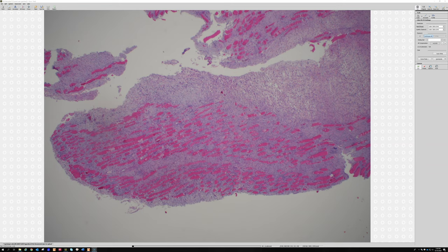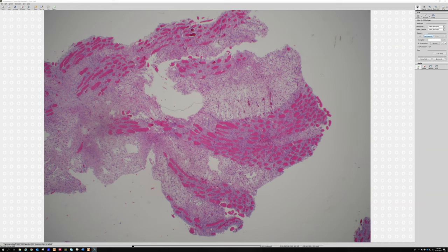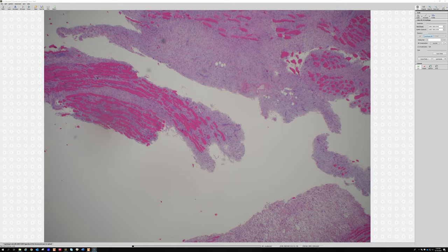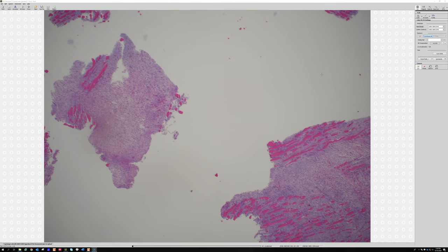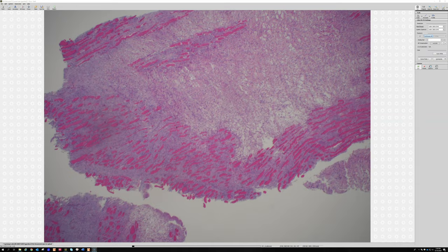Case seven: a 60-year-old male with a rapidly growing three-centimeter shoulder lesion. All these red bundles are skeletal muscle, and in between the skeletal muscle is something else — spindle cells, maybe with a slight bluish myxoid background. This pattern is very interesting: the spindle cells are kind of filling in the spaces between the muscle bundles and actually splaying apart the individual muscle fibers. Let's go a little closer.